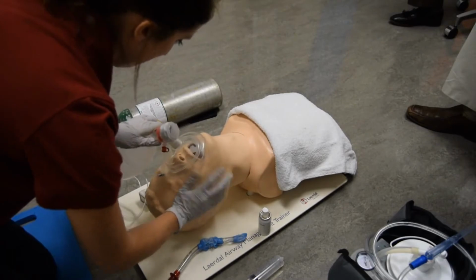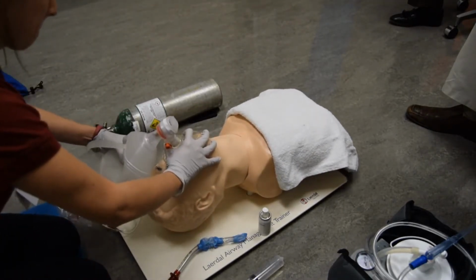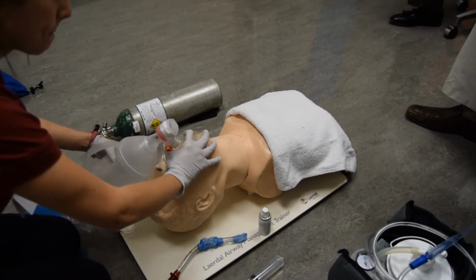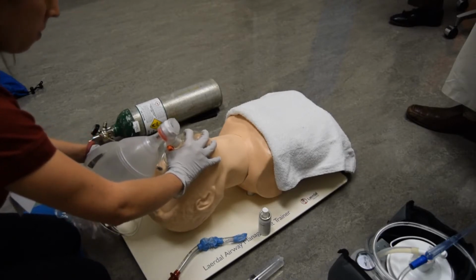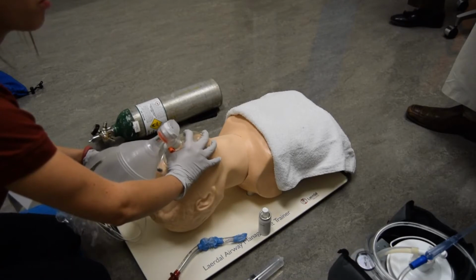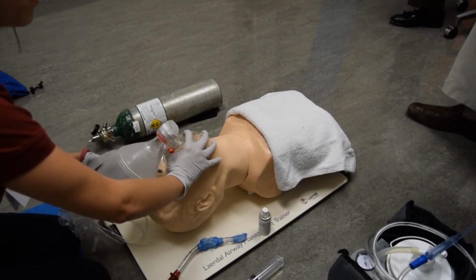Ventilates patient immediately with bag valve mask unattached to oxygen. Ventilates patient with room air. Examiner now informs candidate that ventilation is being performed without difficulty and that pulse oximetry indicates the patient blood oxygen saturation is 85%.